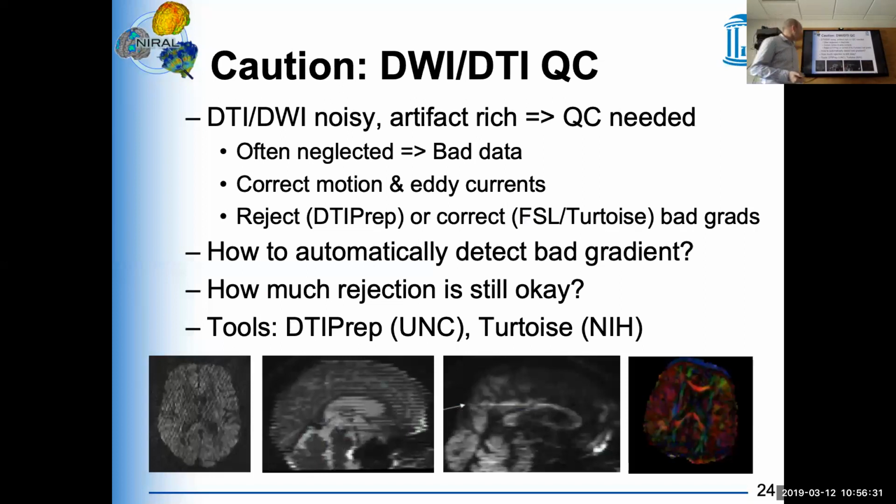And then you rarely see something where, if you look at the diffusion weighted images, they all look good, but then when you go to the FA image, it just looks wrong. Like in this case here, I'm not quite sure you can see this, it's all kind of reddish. It has this bias towards left-right. This happens if there's something wrong, either with the scanner, for example the scanner electronics can be off, or one of the gradients may not work perfectly.